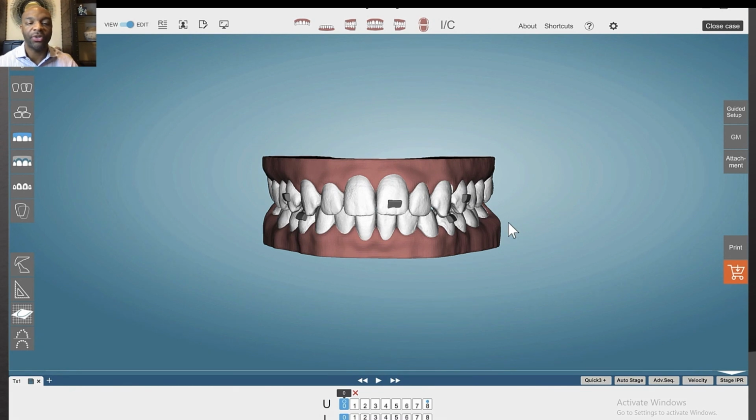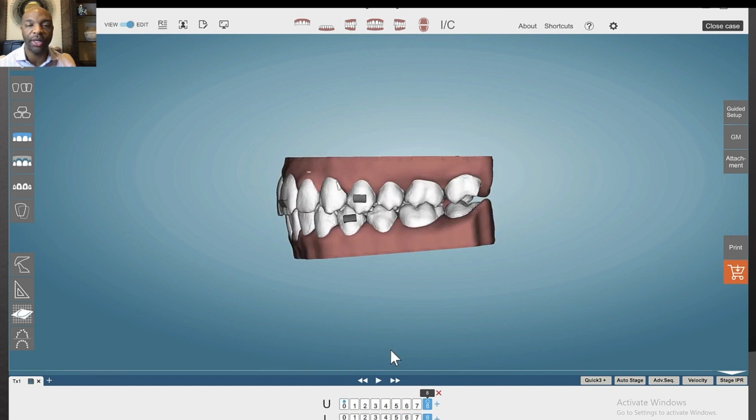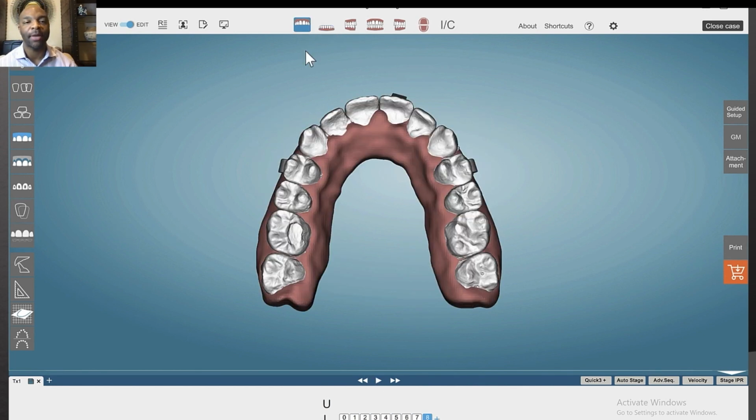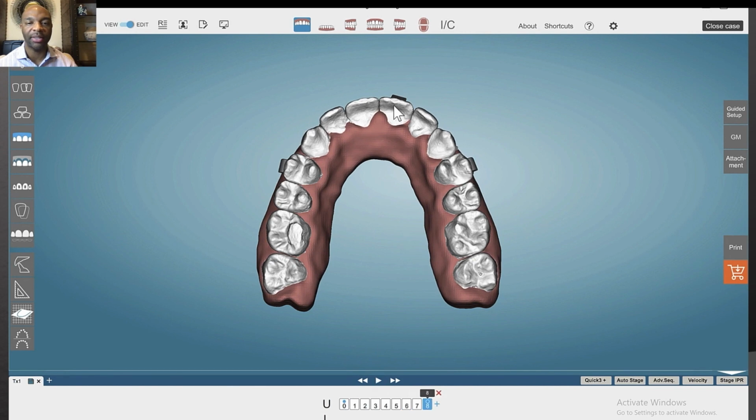And so this is her setup. And again, you can see the buccal overjet with that upper left 3 and how much it was extruded. And so we wanted to intrude it, rotate it in, and give it some palatal tip at the same time, just to tuck it in a little bit more. And then in the lower arch, we just wanted to tighten things up a little bit. Again, it wasn't terrible, but we needed to align things a little bit better in the lower arch. And so we had 8 aligners for the upper and the lower, just to tidy some things up.